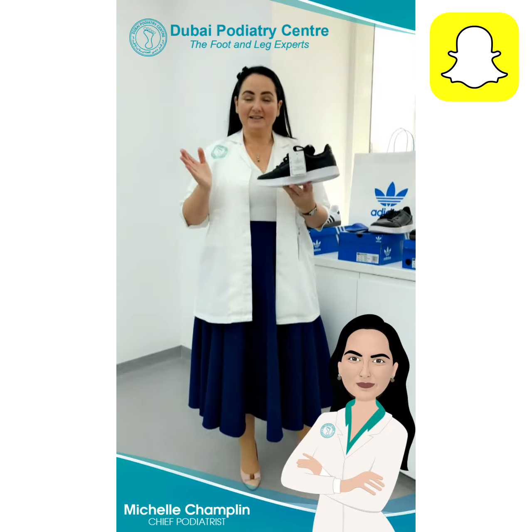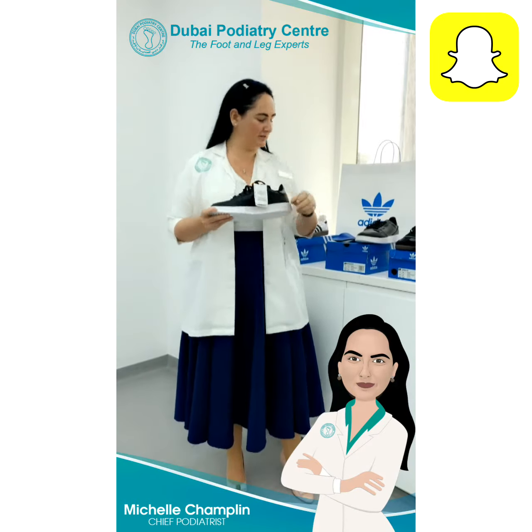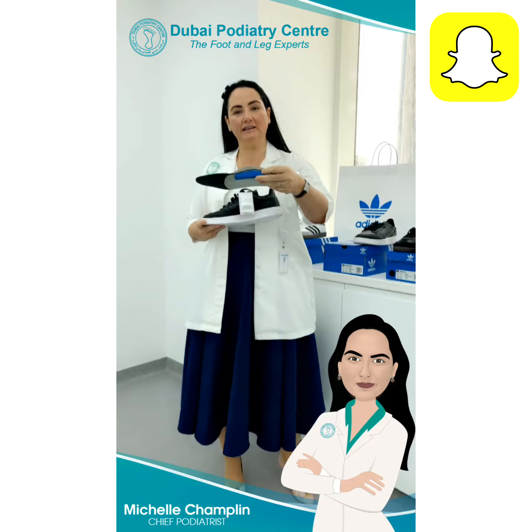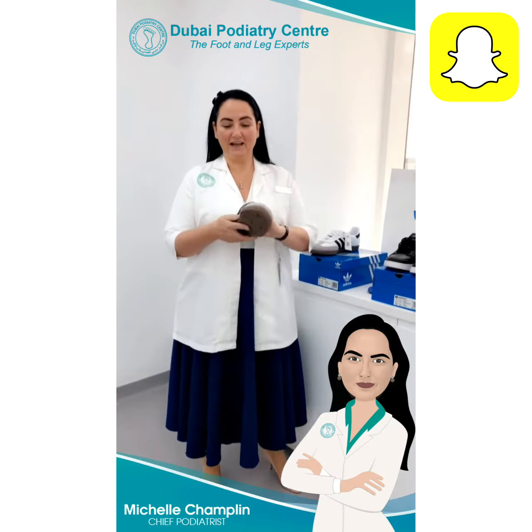These Adidas Super Quartz are absolutely fantastic for orthotics — not only do they have a really strong and firm soled shoe, which is really important if you need a tilted orthotic.